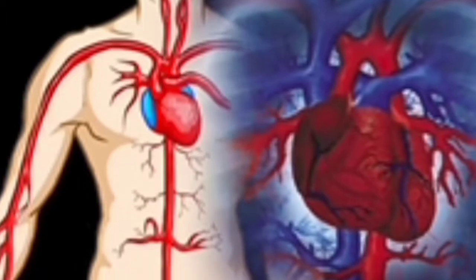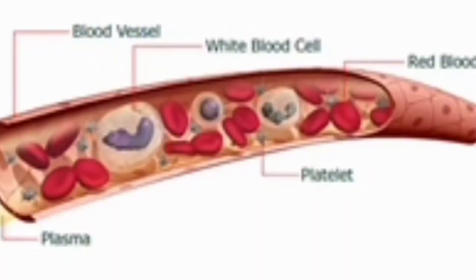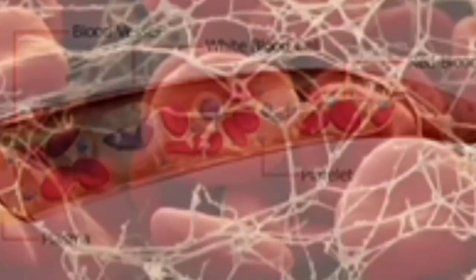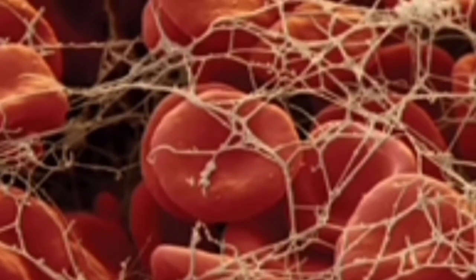Blood grouping experiment. An adult human has about 4 to 6 liters of blood circulating in the body. Blood consists of several types of cells, including white blood corpuscles or WBC and red blood corpuscles or RBC floating around in a fluid called plasma.